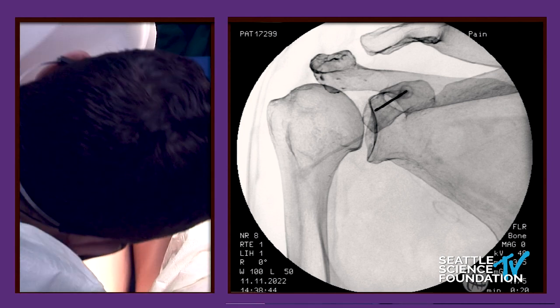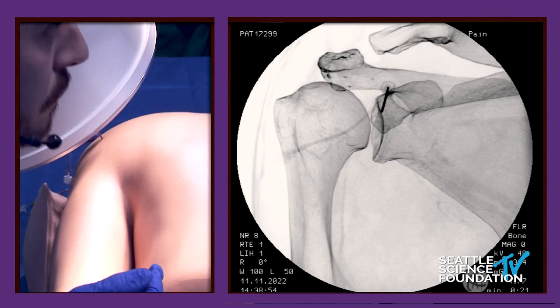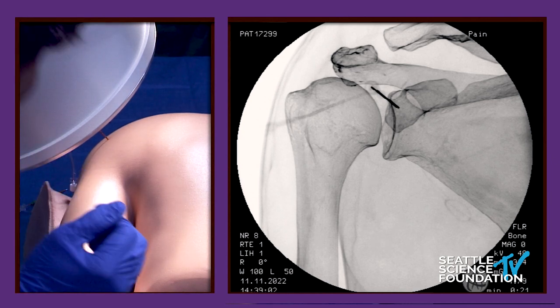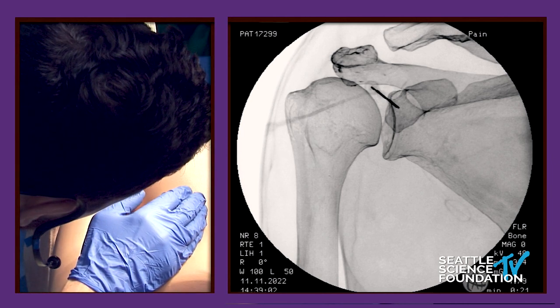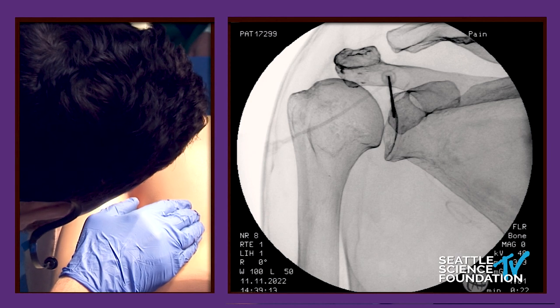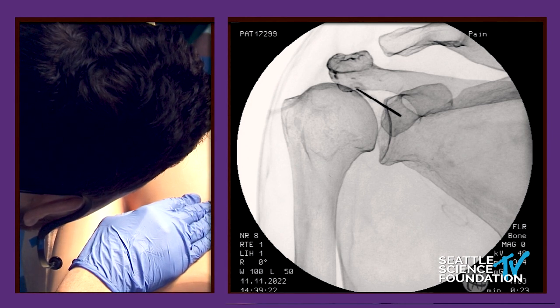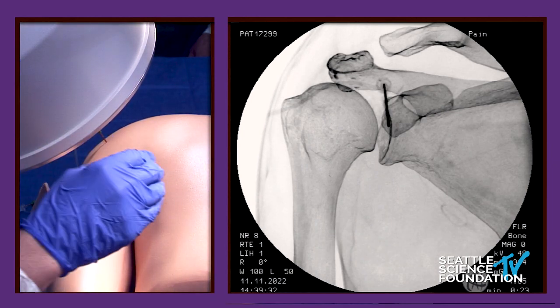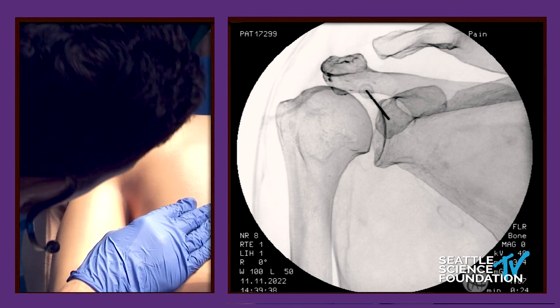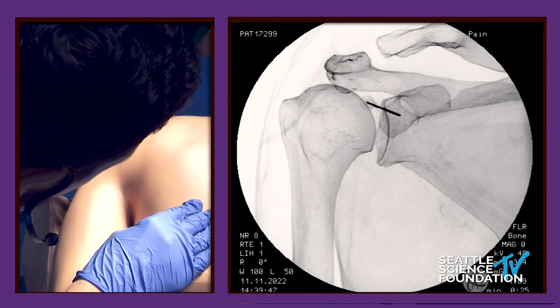So let's direct that more medially away from the joint because we don't want to get our needle into the joint. A rough measure of how big the lesion is — do you guys see the hub of the needle or the introducer itself, that circle? That gives you a sort of estimate of what the size of the lesion will be. So if you can be coaxial, that's always the money shot. One of the interesting things about cooled radiofrequency ablation is that it creates a spherical lesion. So you don't necessarily have to be coaxial or perpendicular like you would with traditional RF where you make an ellipsoid lesion. This is a purely spherical lesion, so your tip can be at any orientation and you're generally going to get a very nice lesion at that location.